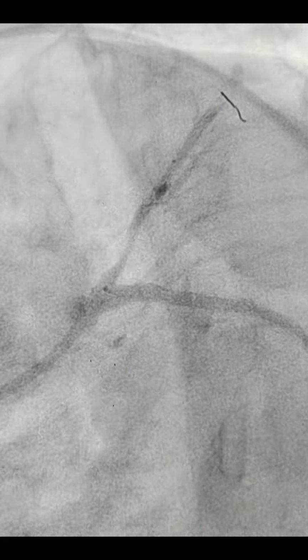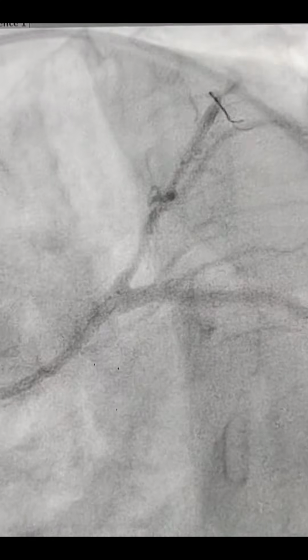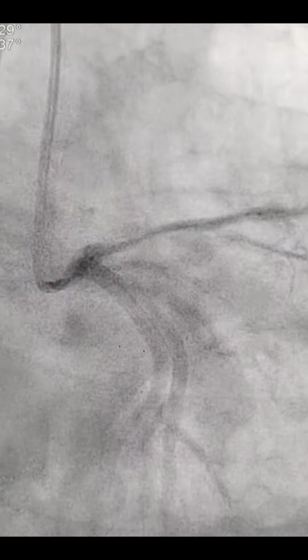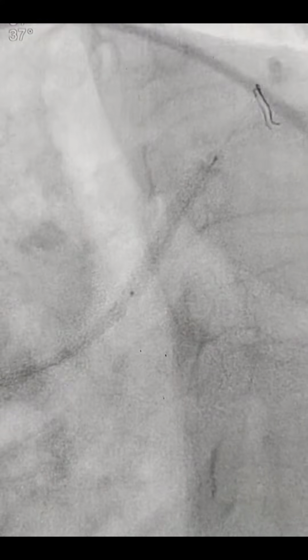So this is the cranio-caudal view, and this is the placement of the stent. We kept one strut just in the bifurcation area, so this is called nailing. So this is the nail the ostium stenting technique. This is the cranio-caudal view just to see the positioning of the stent. And then we deployed the stent at 14 atmospheres.